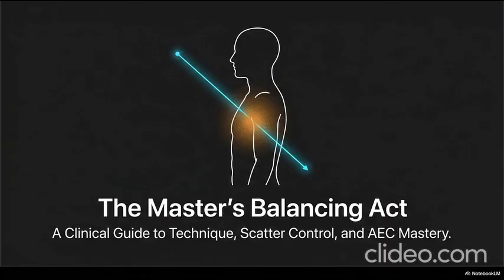Yes. But what happens if you are off by just an inch or two? Say that center chamber is no longer sitting entirely under the dense bone of the spine, but is now partially under the soft, air-filled tissue of the adjacent lungs or bowel. Well, soft tissue and air offer very little resistance. The X-rays blast right through the soft tissue and hit the ionization chamber at high speed. Oh, so it fills up really fast. Almost immediately. The chamber fills up its electrical charge and shuts off the X-ray tube. The machine thinks it did its job perfectly. But your image of the dense spine will be drastically underexposed, a grainy, unreadable mess because the exposure was cut off based on the density of the soft tissue next to it. Wow. So positioning is literally everything.